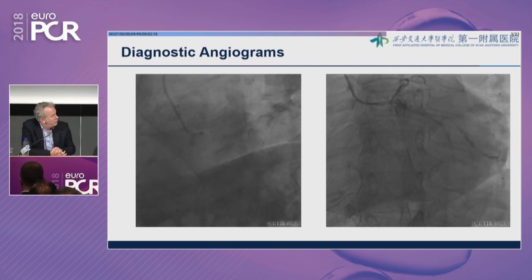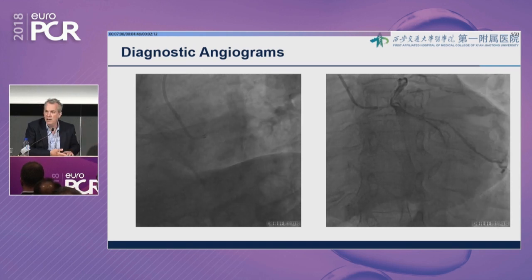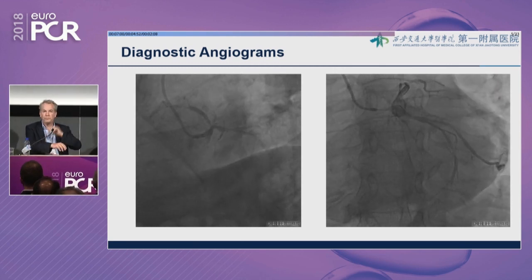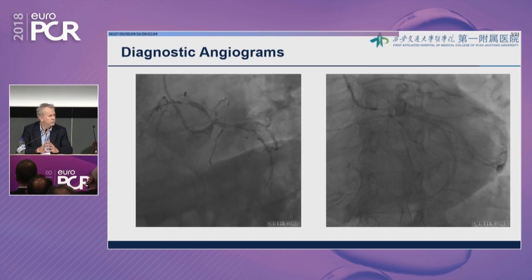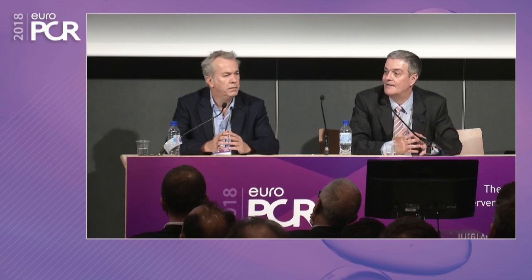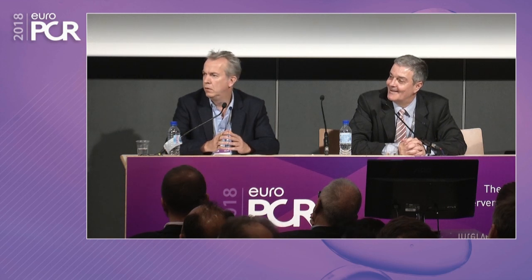Okay, any other comments you think we should discuss? Anyone want to raise any other questions or comments? If someone wants to tell in a little more detail what the strategy would be, just stratify between the different available two stent strategies, not just two stent strategies up front. I mean, TAP is also a two stent strategy at the end, but you start as provisional, leaving the option. Maybe we can ask Francesco. Is there a microphone?